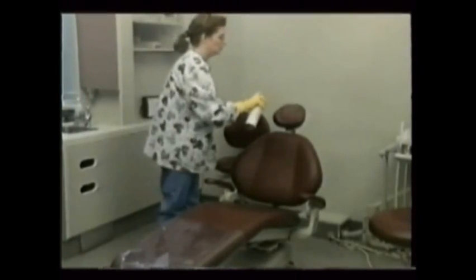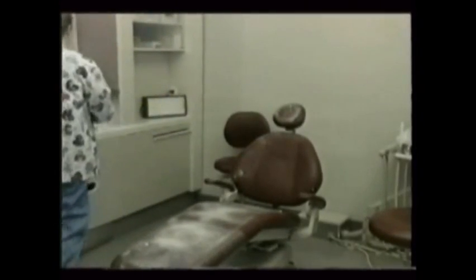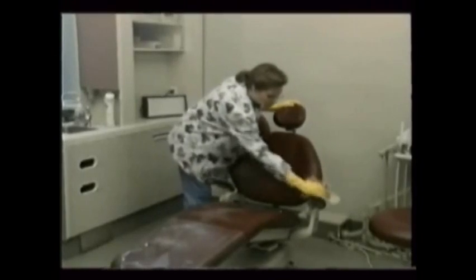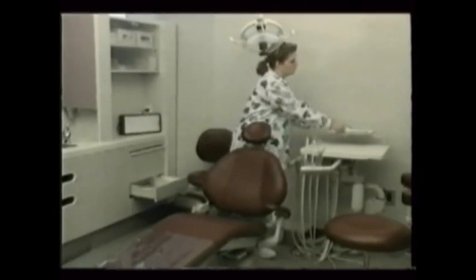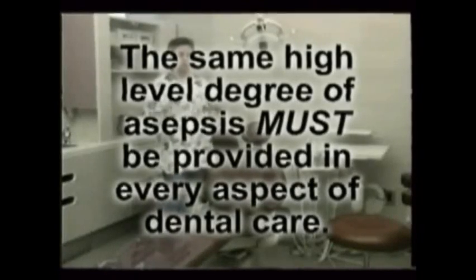Before the patient is seated for the surgery, all needed instruments must be gathered and the treatment area properly prepared. Drape and disinfect all surfaces as described in the infection control film. Oral surgery doesn't demand enhanced infection control techniques. The same high-level degree of asepsis must be provided in every aspect of dental care, not just oral surgery.